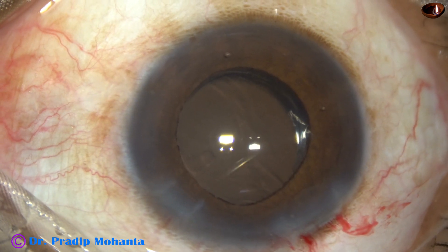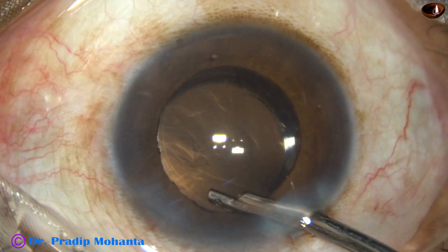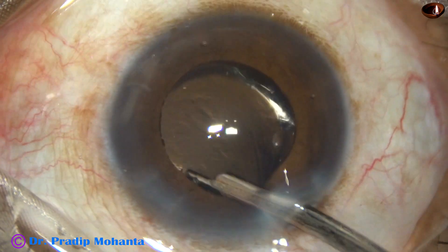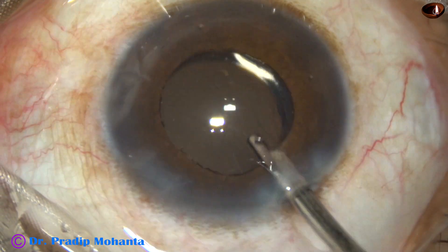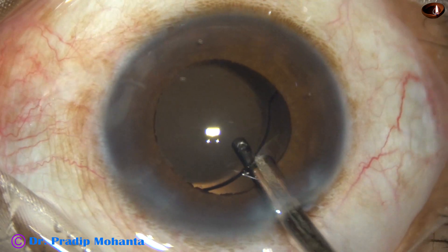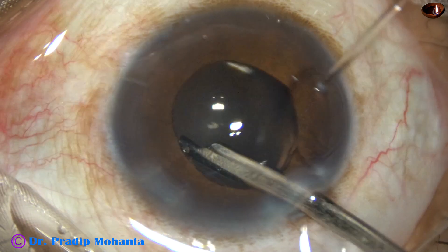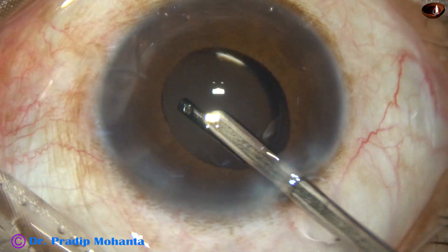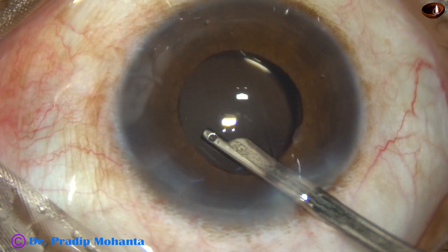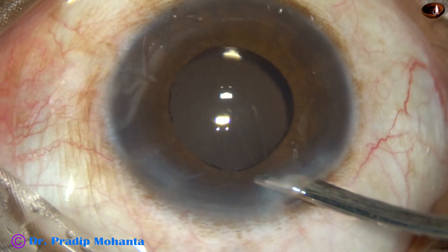First I am going to use the 23G Simcoe. This is double irrigation — I have taken some BSS in the syringe and I am flushing it out as well as normal irrigation is happening. By double irrigation we can forcefully irrigate out a lot of viscoelastic substance from behind the intraocular lens — that is from the capsular bag, from the anterior chamber, from the posterior chamber. About 70% to 80% of viscoelastic substance comes out by this maneuver.